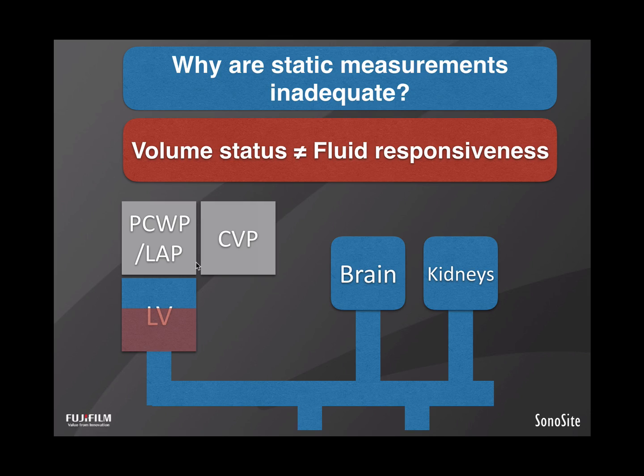We just don't know how patients will respond until we are able to test it with a trial and measure the response. And as we'll describe later, bedside ultrasound now allows the clinician to assess this trial both at the LV as well as in the major arteries.